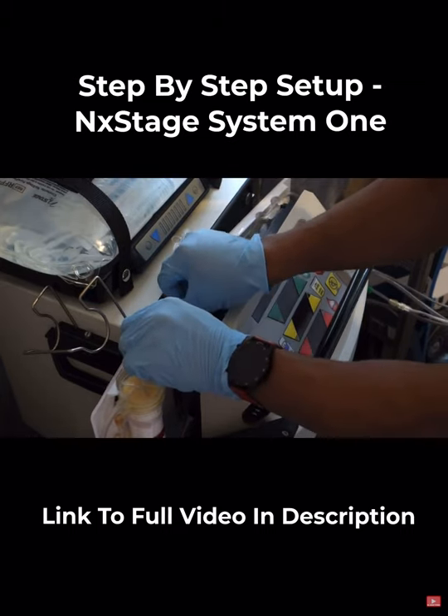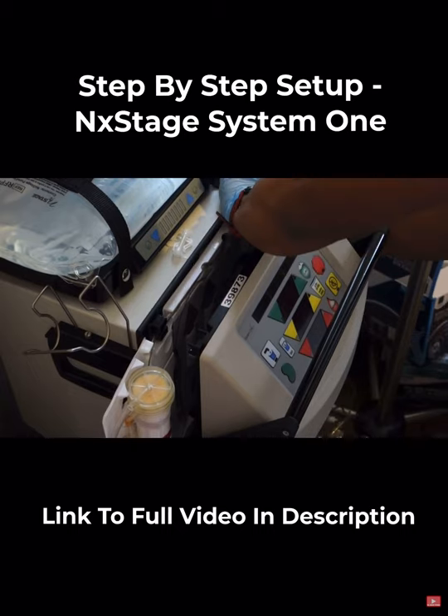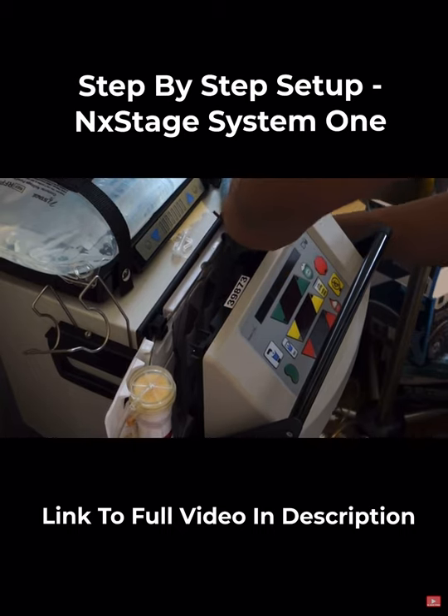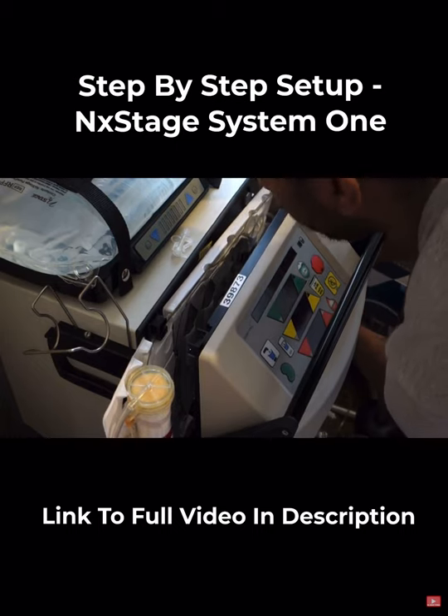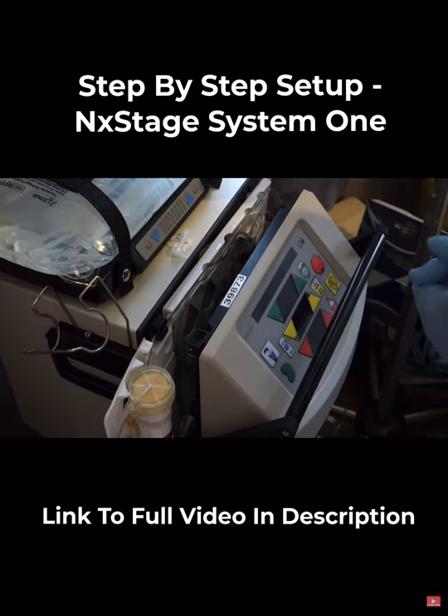You've got one here on the left hand side of the machine, another just inside the machine which you can't see from this shot, and there's another in the bottom right hand corner. Make sure you follow the training given to you by your unit.